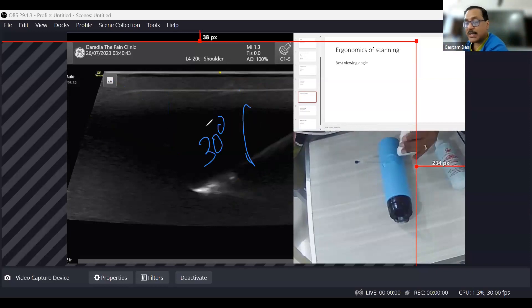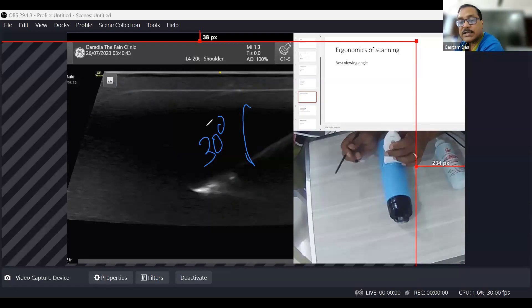Your needle entry point should be positioned accordingly. If you go a little deeper — meaning further away from the probe — your needle will be more horizontal. Taking the needle entry point further away from the probe allows you to reach the target while keeping the needle almost horizontal.